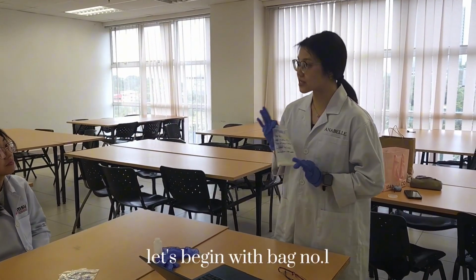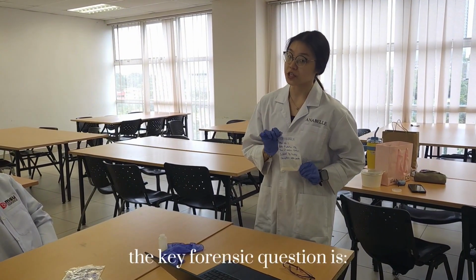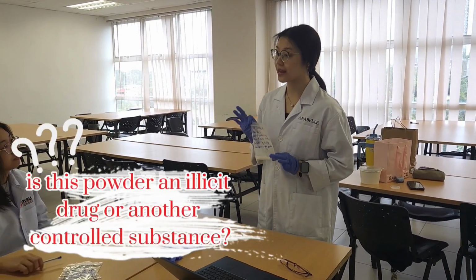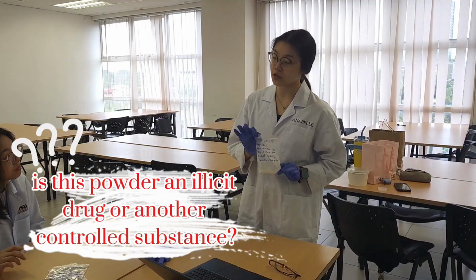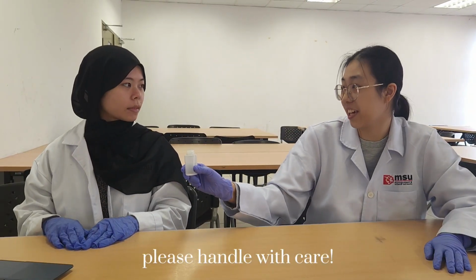Alright everyone, let's begin with bag number 1, the white powder. The key forensic question is: is this powder an illicit drug or another controlled substance? Here's the alleged white powder, Lamia. Please handle it with care. Of course.